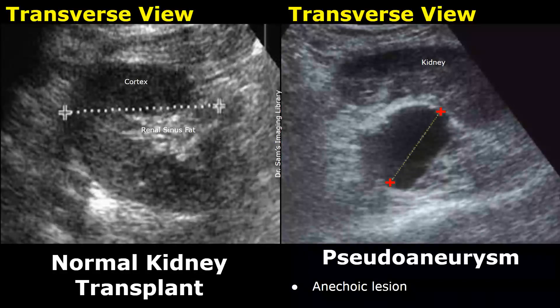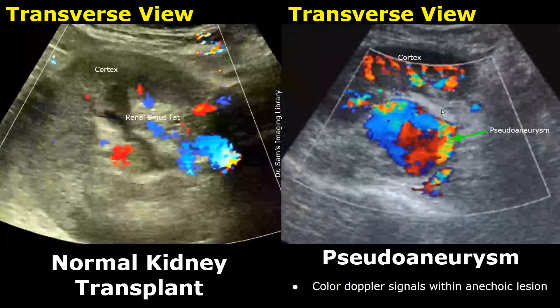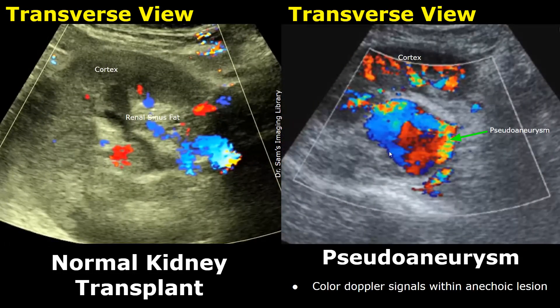Pseudoaneurysm may occur in our transplant kidney after biopsy, and these pseudoaneurysms usually occur at the site of biopsy. It will appear as an anechoic lesion. When we apply color Doppler, this anechoic lesion will show blood flow — we will find color Doppler signals within it, which will confirm that it is a pseudoaneurysm.